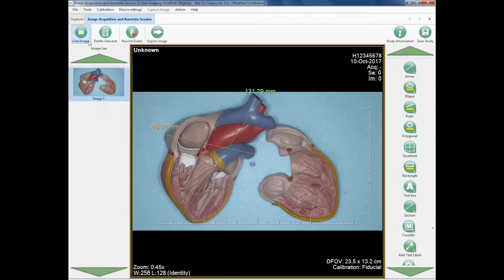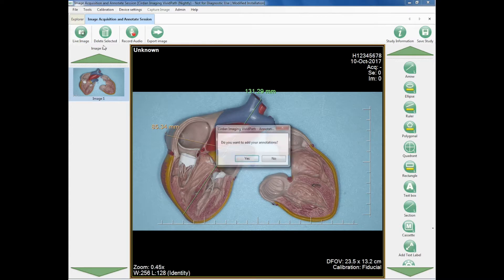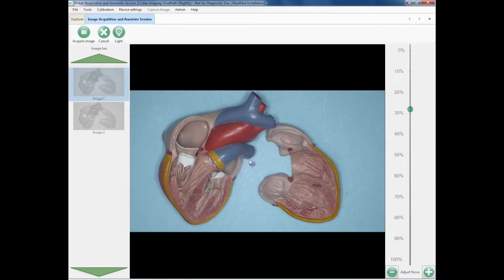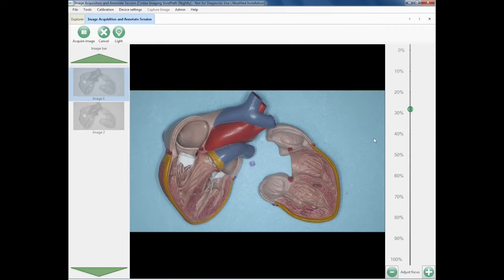Once I have that, I can go back to the live image, it asks do I want to save my annotations, I'll say yes, and it's now created the second image with the annotations.